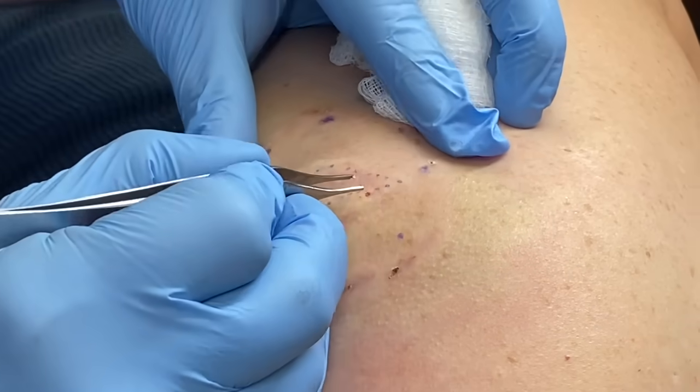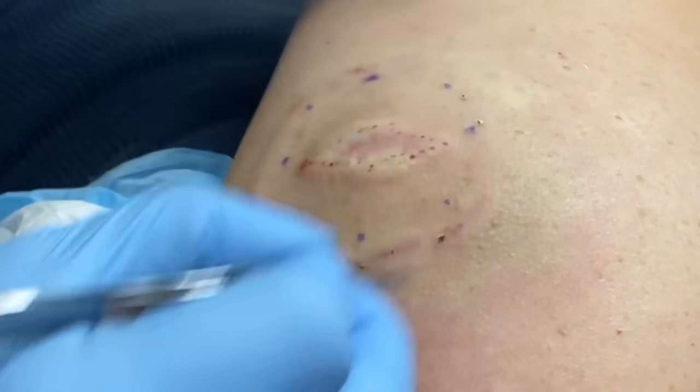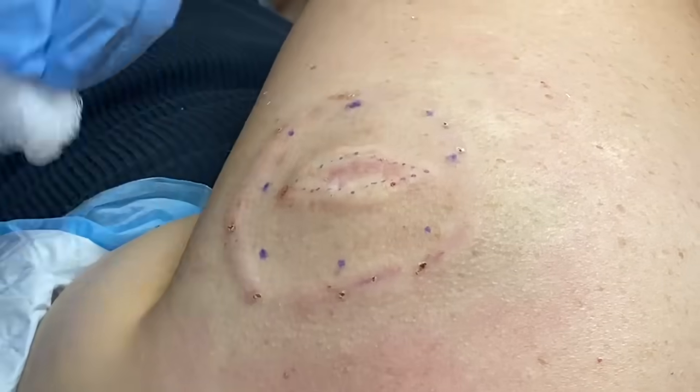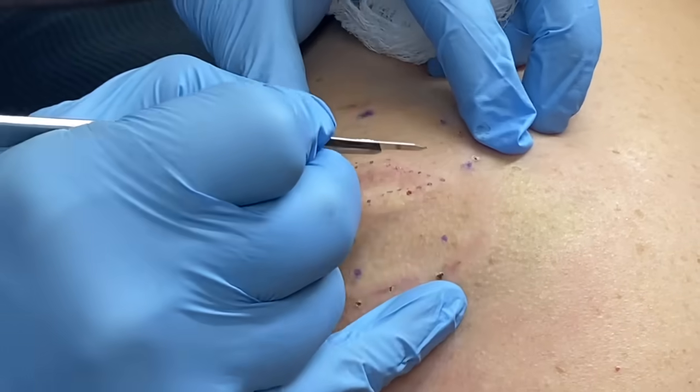So this is all frozen through here. And no pain when I do that? Nope. So this is an uninfected field, so we should have excellent anesthesia. If at any point in time, and we had this conversation before, you feel anything other than just pressure, let me know and we just add some extra in. Okay. All right?